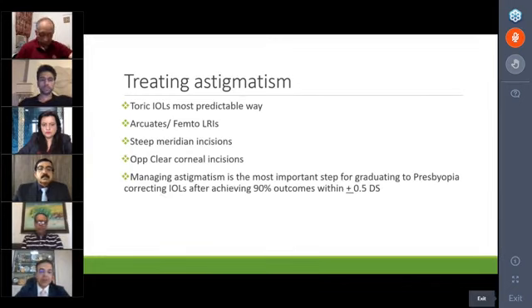But for me today, toric IOLs probably are the best way, and we have a huge range of toric IOLs available. And today ICE is doing this symposium, but I use all various company toric IOLs, and they're all great. I like the Zeiss ones. I like the ones which come from J&J, from Alcon, and even the Indian lenses today are excellent.